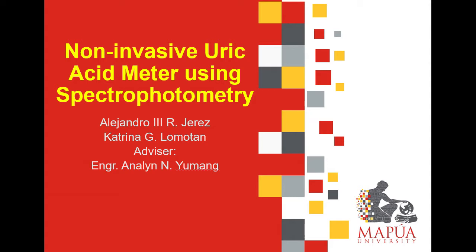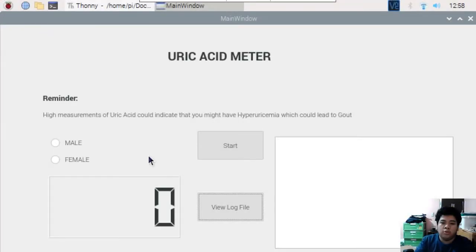Good day, I am Alejandro R. Harris III, and today I will demonstrate how our thesis non-invasive uric acid meter prototype works.